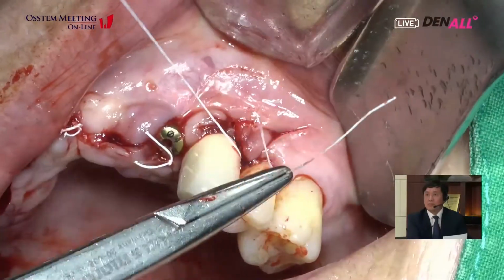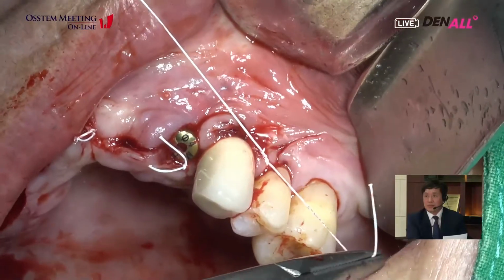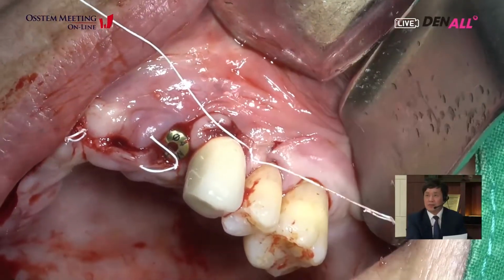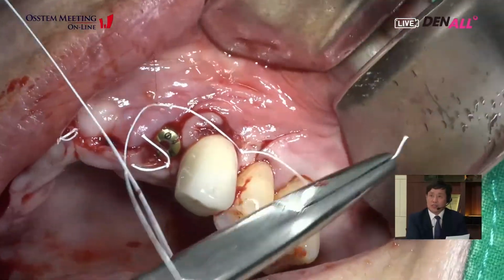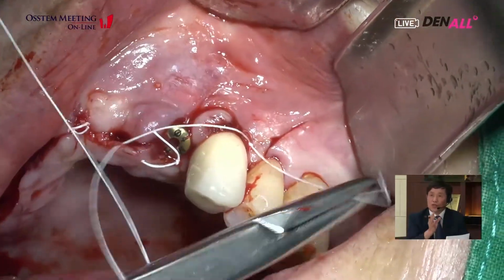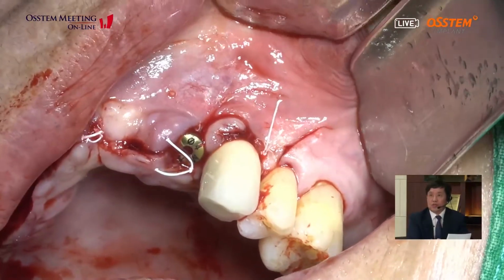Papilla between first premolar and second premolar area. Yeah, he already did the periosteal releasing abundantly, so you can see the flap approximation is very good and there is no tension.